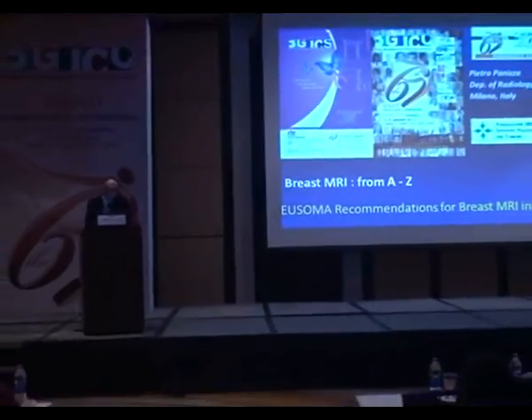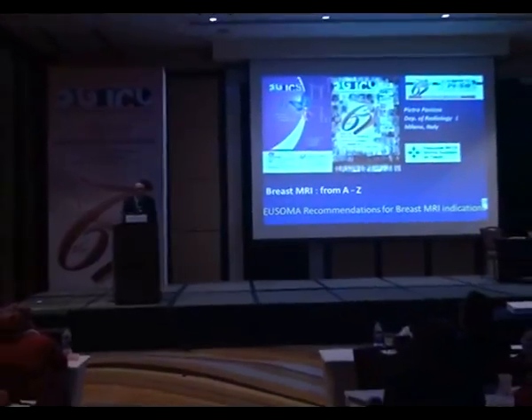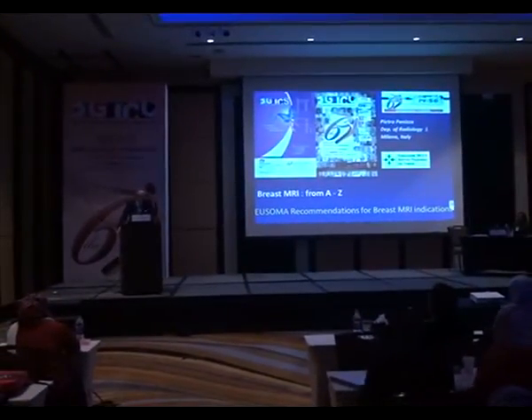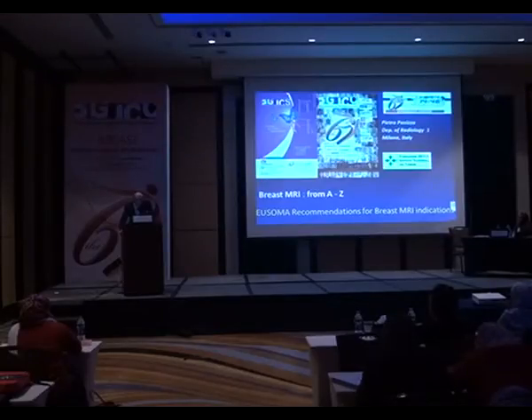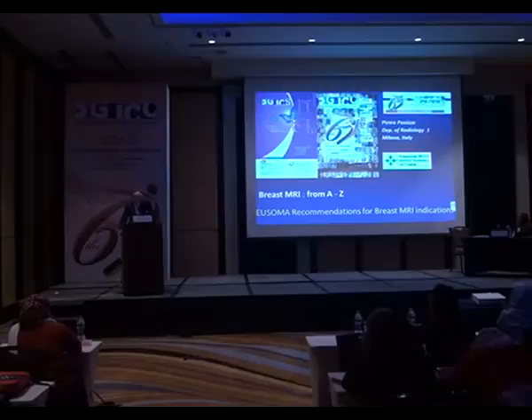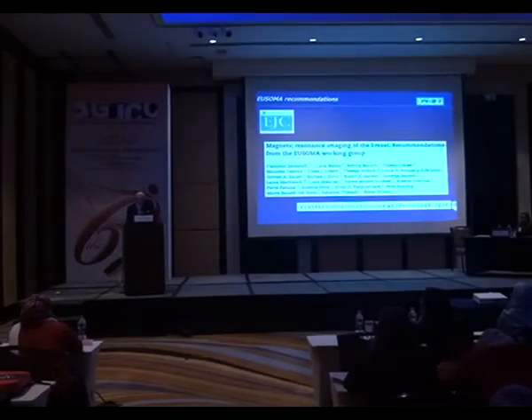So EUSOMA is the European Society of Mastology. That is a society where oncologists, radiologists, radiotherapists, surgeons, and so on, people working in a multidisciplinary team, are together. About 3-4 years ago, we met in Milano to write a document with recommendations and suggestions on the use of breast MRI.